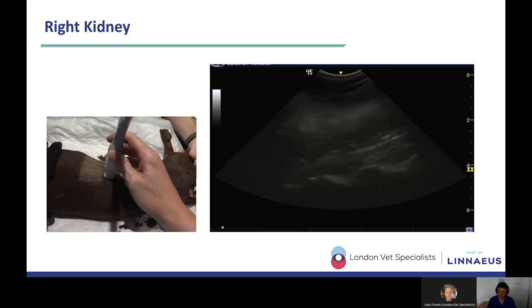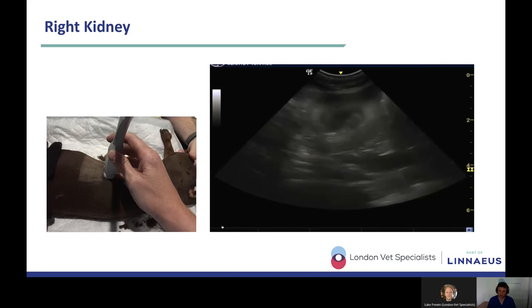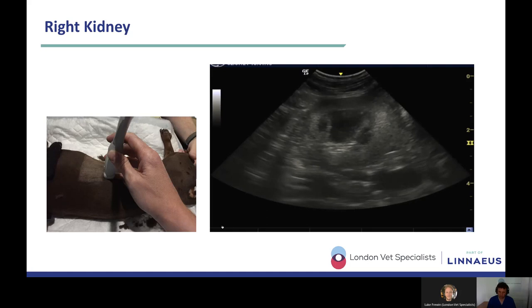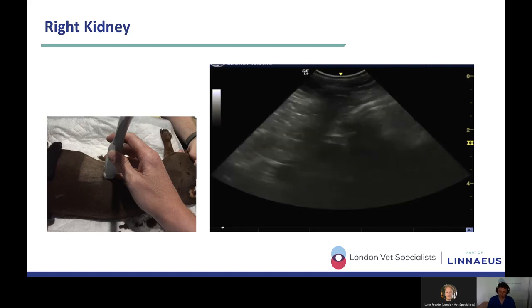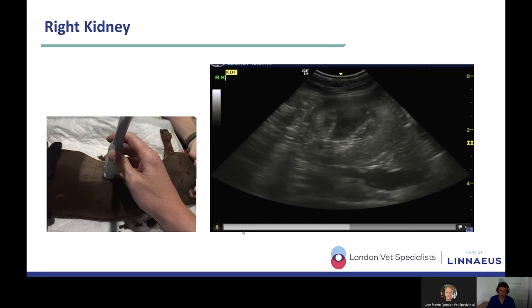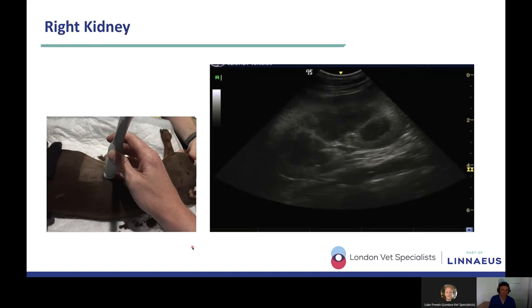And then once you can do that, then you can start measuring the renal pelvis and get a little bit more confident about your measurements. And then you'll start to be more confident at making significant judgment calls about how those measurements might significantly influence the ongoing treatment and prognosis for that patient. But at this stage, just get used to getting a nice short axis view of the kidney and recognizing the renal pelvis. Okay, don't get too hung up on measurements.